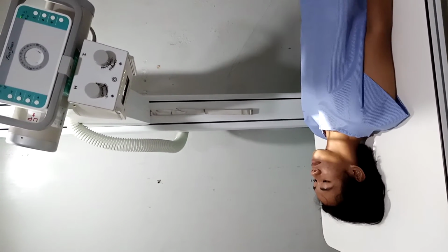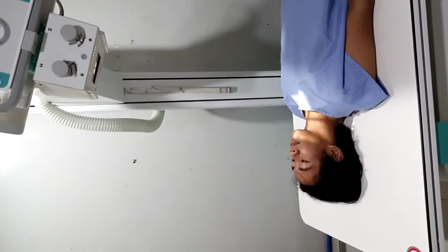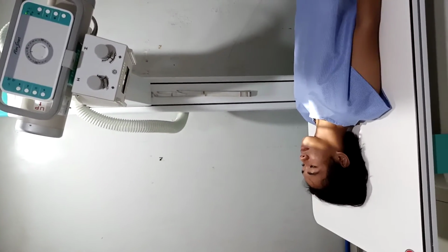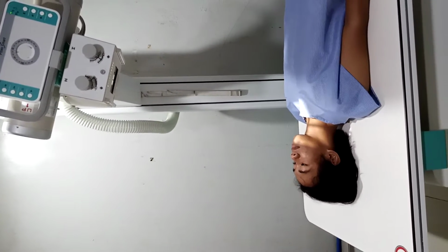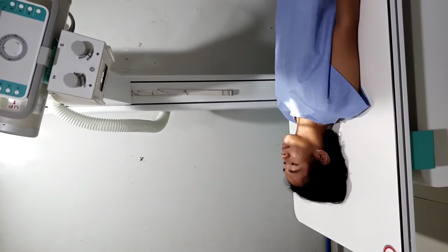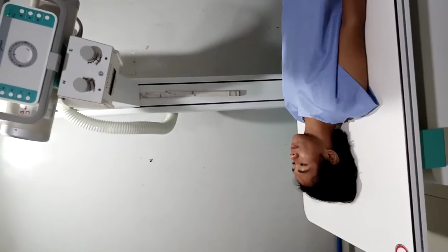Then, in position, there should be no rotation, as indicated by the spinous processes and sternoclavicular joints, if possible. They should be equidistant from the spinal column's lateral borders. Then the mandible and the base of the skull should superimpose the first two cervical vertebrae, then the collimation area of the rest.